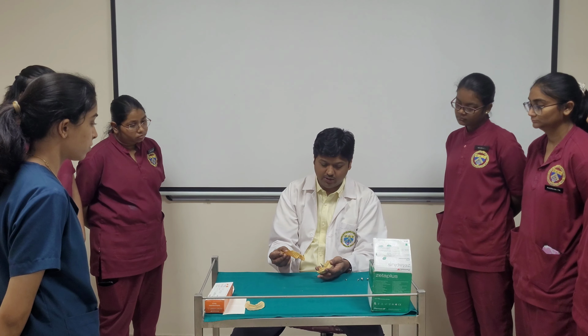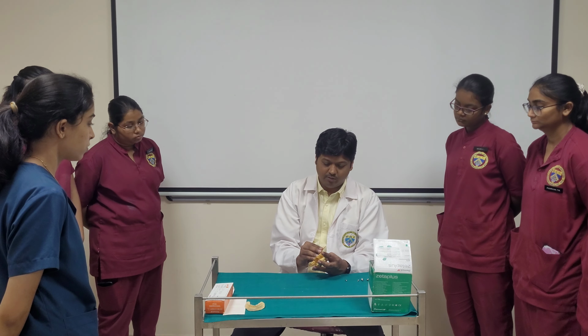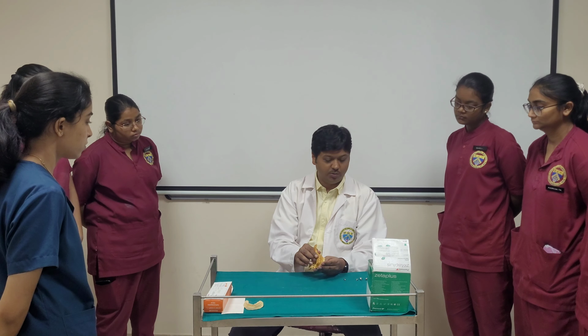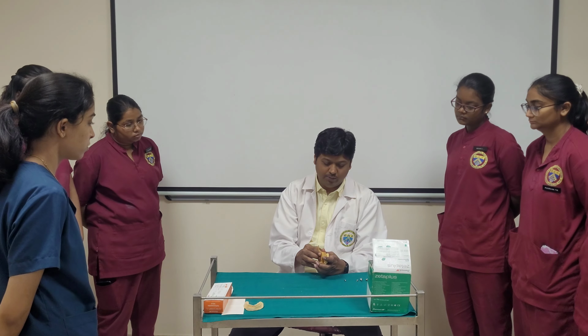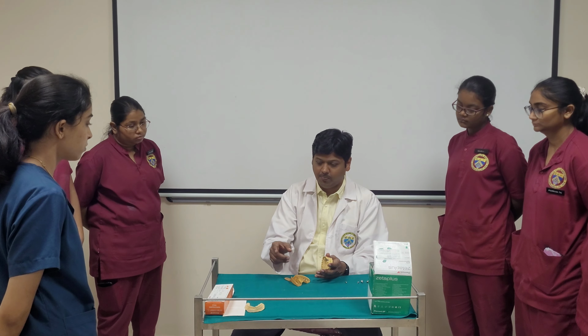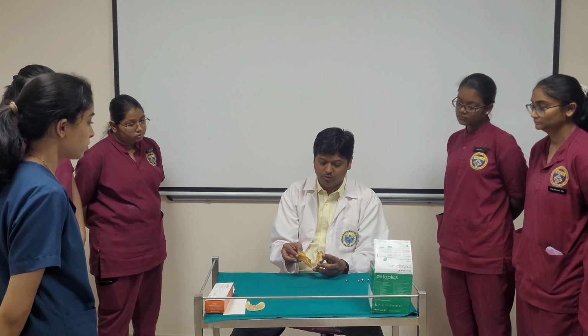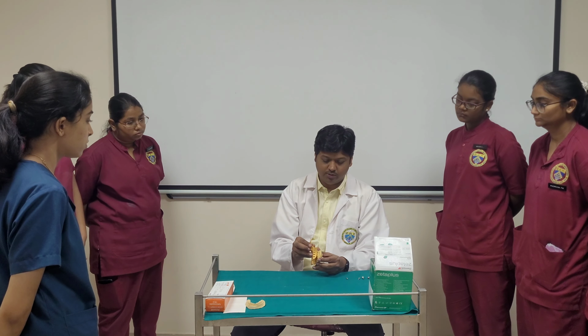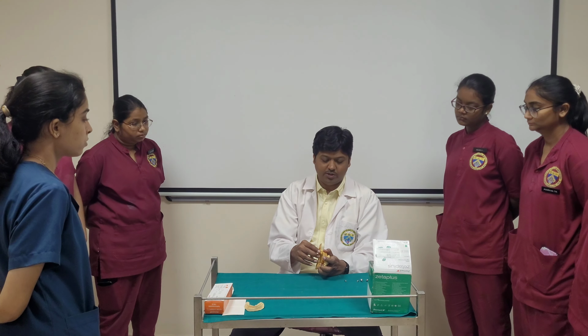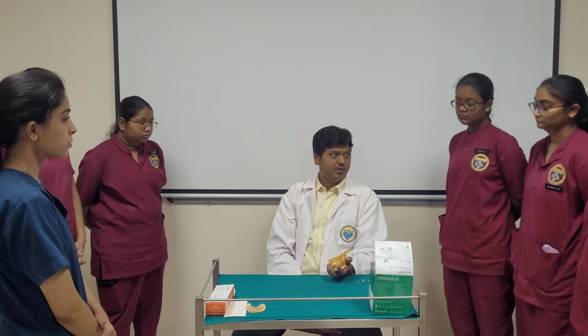Then we have to select the tray and we have to make a hole in the tray so that this extension comes out of the tray. And when you make the impression, we load the putty inside the tray and light body in the patient's mouth, and we will close on the transfer coping just like we make our regular impression, and this extension has to come out of the tray.